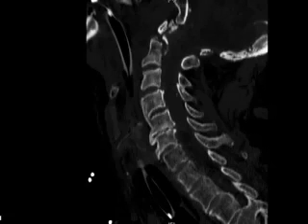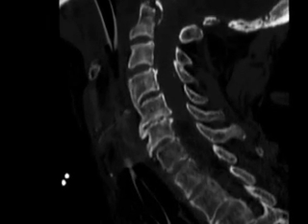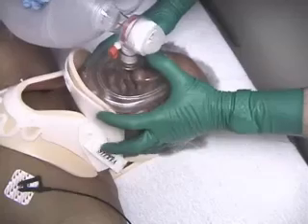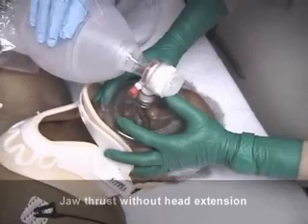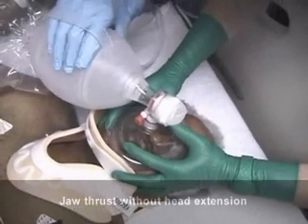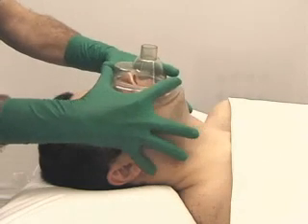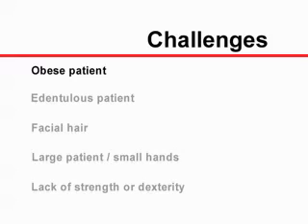Extreme caution is advised in patients with cervical spine injuries, in which flexion or extension of the neck is contraindicated. In this situation, the jaw thrust maneuver alone, without head extension, is recommended. It may be difficult or impossible to maintain an adequate seal using only one hand.